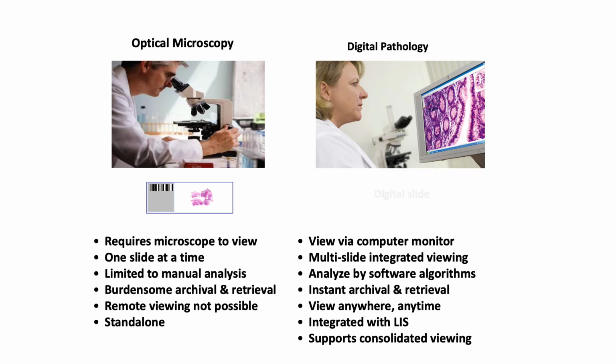To retrieve old slides from archival for an optical microscope, you have to ask a technician to bring you the slides from storage, which may take some time. With digital software, you can retrieve and analyze the slides in minutes, which is important for clinical patient care. Remote viewing of slides using an optical microscope is not possible unless you have an attached camera. With digital software, you can retrieve slides anywhere and anytime. These examples show how flexible digital pathology is, and how important for clinical patient care, compared to optical microscopic analysis.